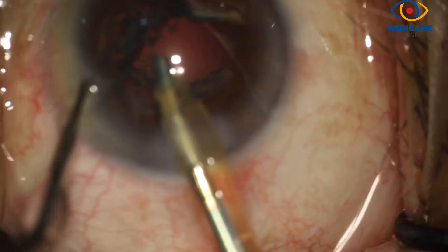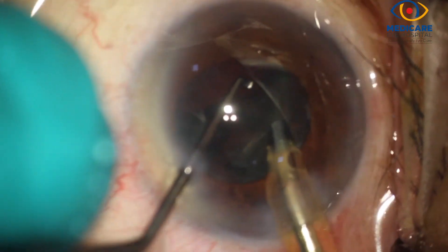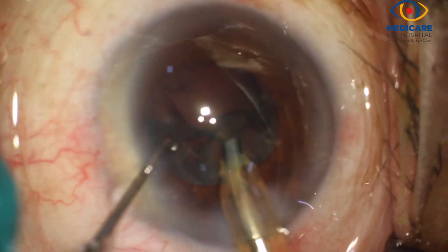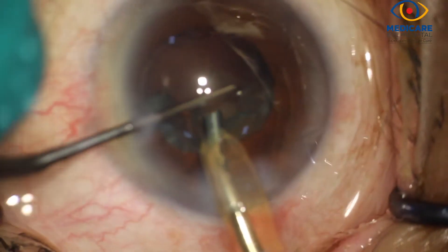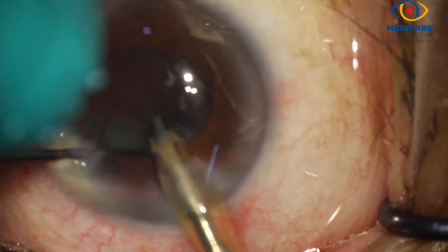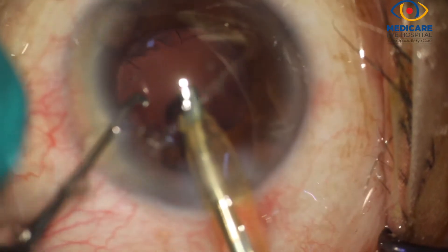After complete removal of the nucleus, what you can see is the thick epinuclear sheet, which has formed because of the complete hydrodelineation performed earlier. This is engaged in the epinucleus mode of the phaco machine and is emulsified with low phaco power. The sub-incisional epinucleus is also being cleared up now.